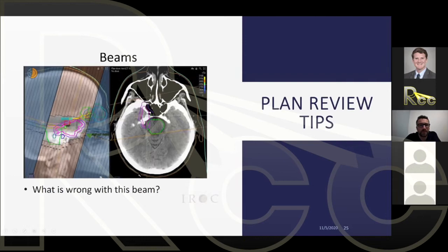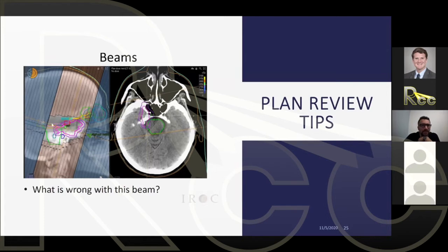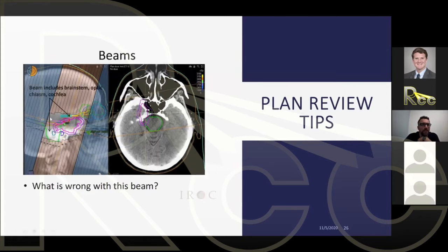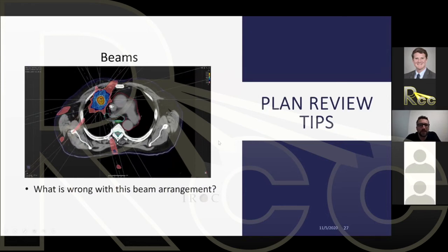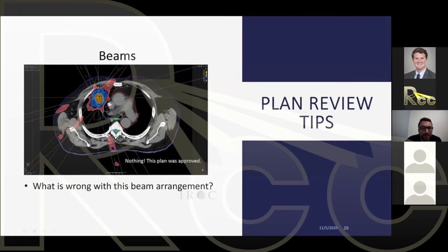Looking at a beam's eye view of a beam entering obliquely into the brain: you can see the target, brainstem, chiasm, and cochlea — the beam aperture is way too open. You could definitely tighten it to make it far more conformal. Another example shows a beam with the spinal cord apparently in the path, but this is the exit beam — the entrance is on the other side, so it's actually acceptable. Sometimes things look concerning but are technically fine.